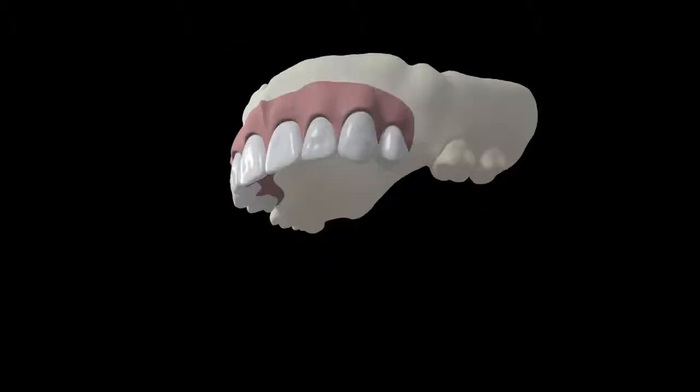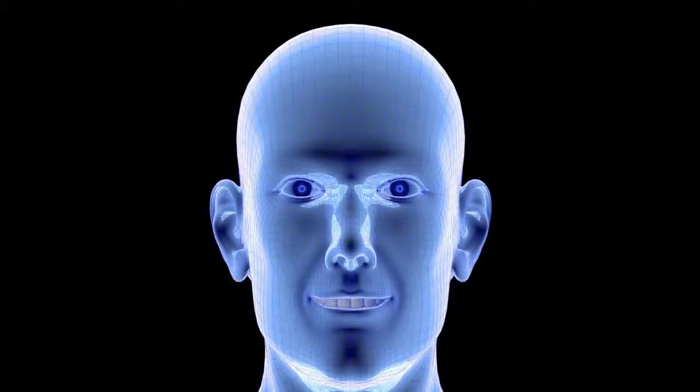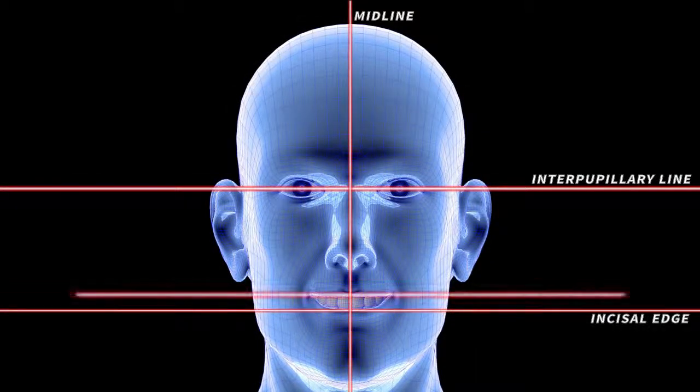Adjusting the position of the teeth on the guides is very easy. The wax is softened and in the maxillary arch, the teeth are adjusted to the proper lip support, midline, incisal edge, gingival margin, and individual aesthetic arrangements.